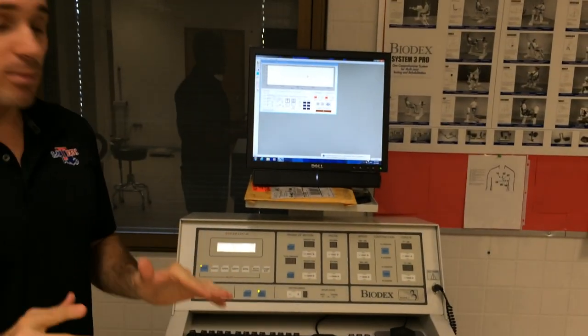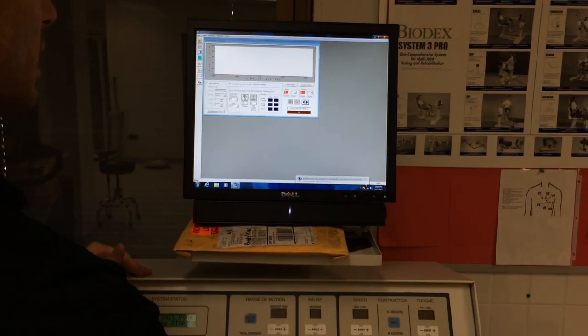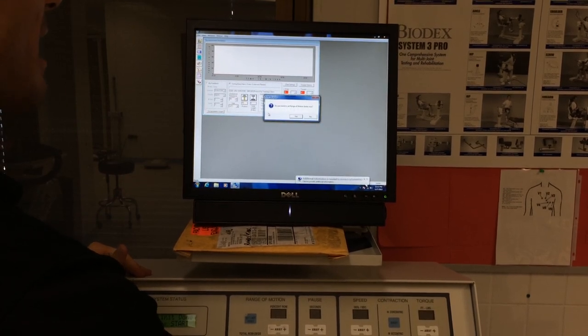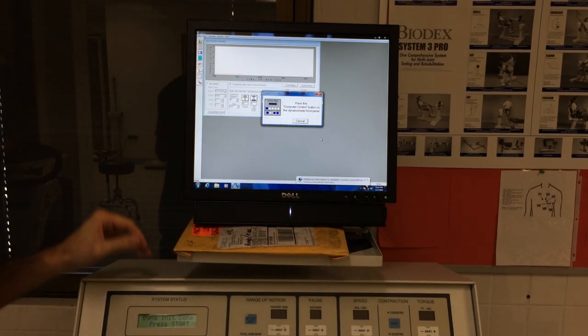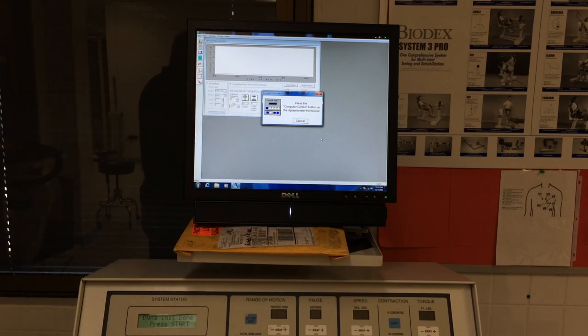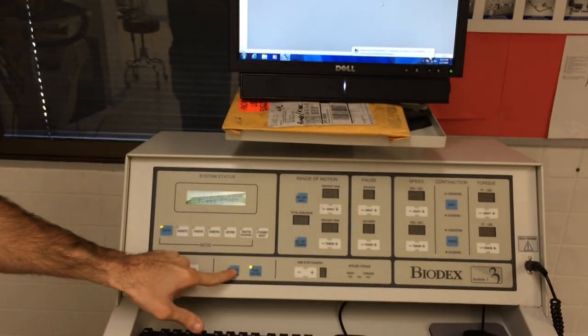The first thing we need to do at this point is set his range of motion. We're going to click this button right here, which is going to allow us to do his range of motion. So we click here on what looks like the T. It's going to ask us, do we want to set range of motion limits? We hit yes. Then it's going to ask us to press the computer control button on the dynamometer front panel. We look right down here, we see computer control. All you have to do is push this.